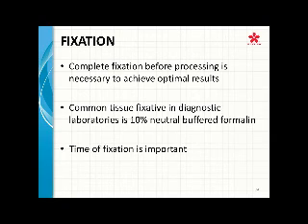Sometimes if tissue's underfixed, it won't stain at all, which is why there are very strict guidelines out by CAP-ASCO for the detection of ER, PR or HER2 markers when it comes to predictive testing for breast cancer. Very largely in part to do with how important fixation is with immunohistochemistry. I cannot say that enough. I've actually personally seen when things have not been fixed properly and how that can negatively affect immunohistochemistry staining. So going to the next slide.